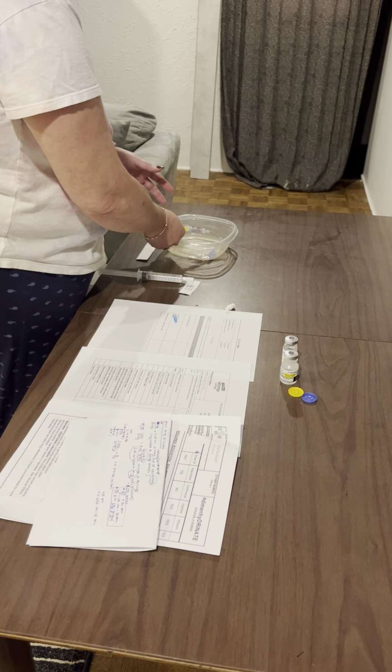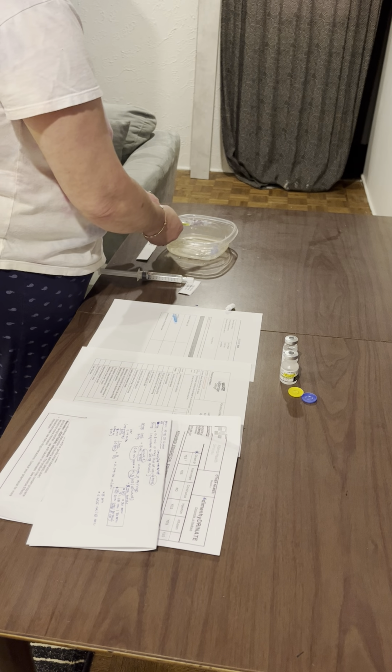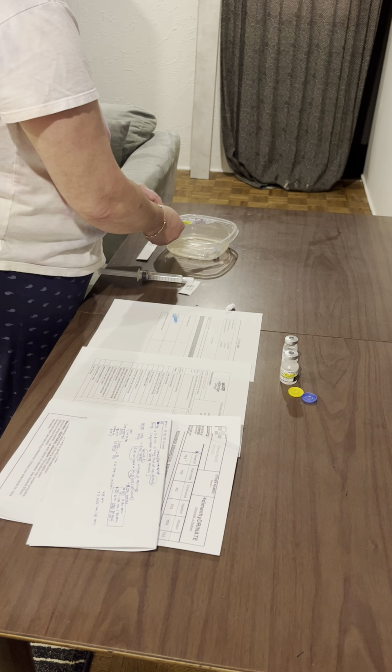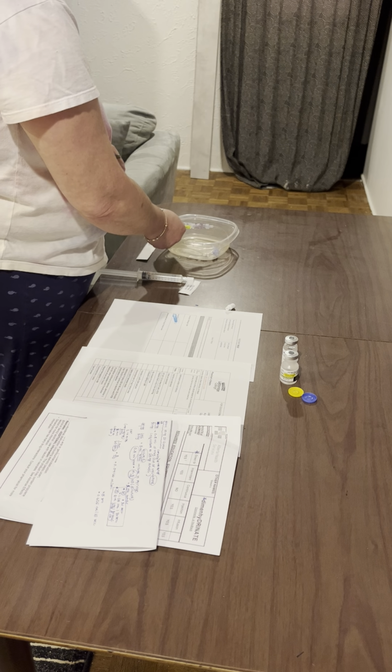We're also going to monitor the patient during this to make sure the patient is not having any issues. Okay, so we're assuming that everything's okay. So we're going to go from 4 now to 3, which is another mil. Then we're going to wait another 30 seconds.